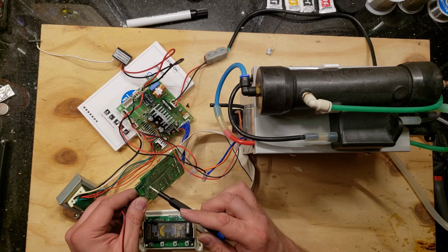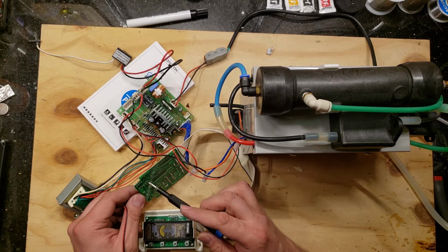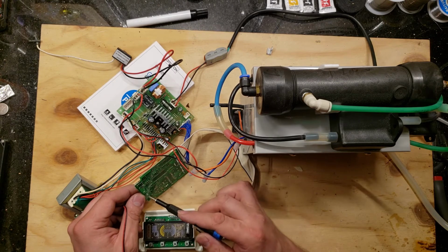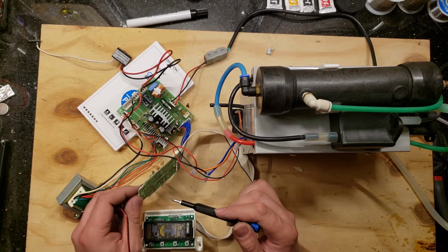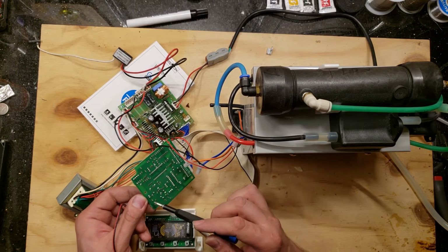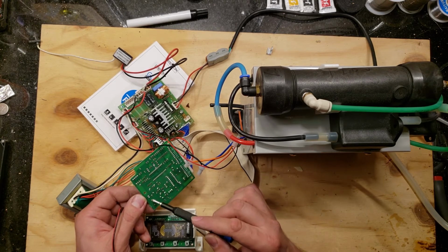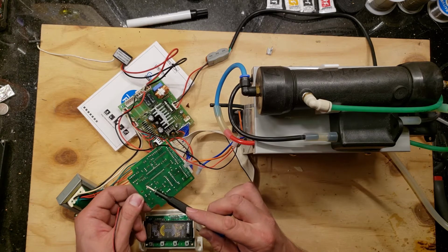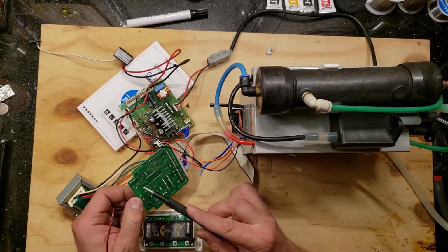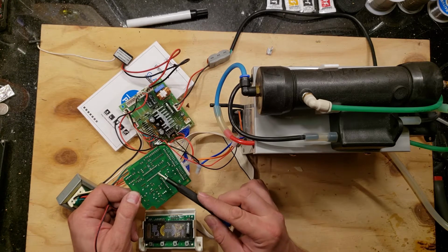So that's going to the chip. So it looks like this thing is going here. Let's see. It's a thicker trace, so I'm assuming this is probably ground. Yeah, so one of these is ground, and then the other one is going here, which is a capacitor, and here, which is a resistor that's going here, that then goes straight to the chip.